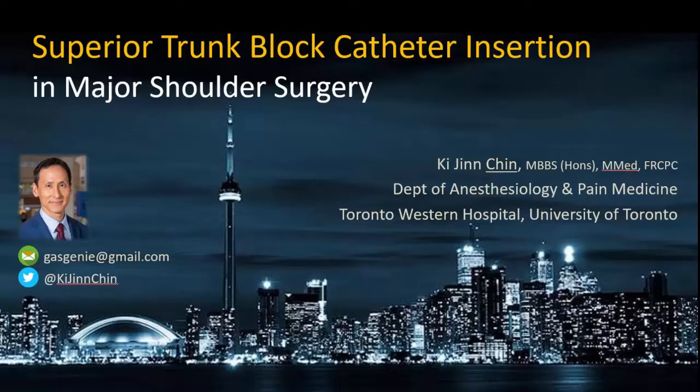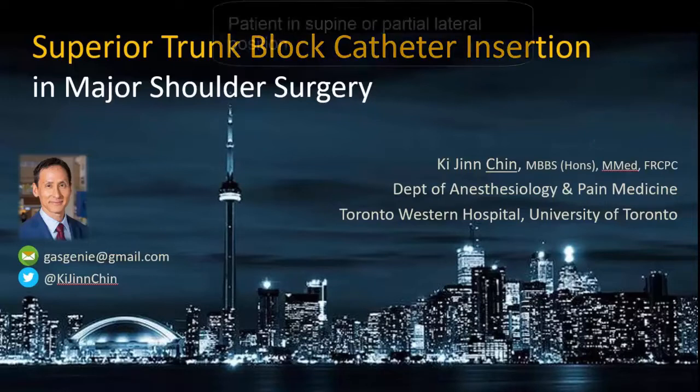This video will demonstrate the insertion of a superior trunk block catheter using a catheter-over-needle set. Note that preparation of the equipment and draping of the patient are not shown, only the insertion process itself.